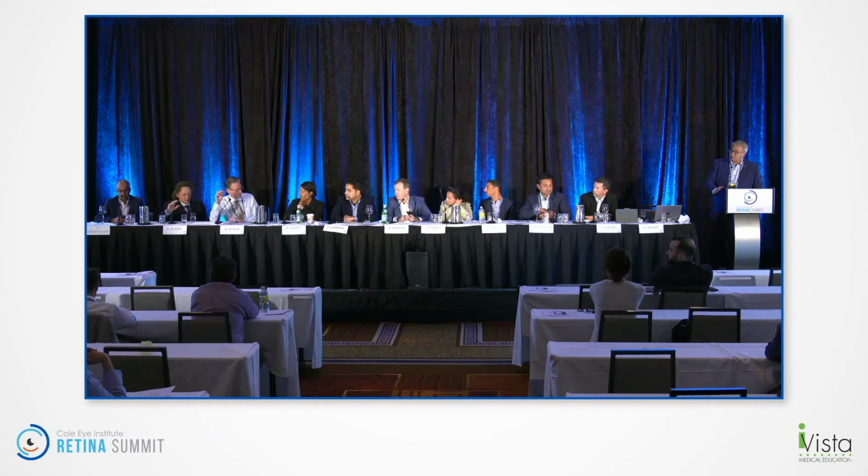Hey, Rick, your analysis, was this just using a standard Heidelberg OCT, and was it your own specific software analysis, or how'd you do it? Yes, it's my own. We changed the Heidelberg software through the A scans before the Fourier transform. That's going to be the part that's coming out. It's a slower scan that gives the greater detail. But the whole idea of then how to process it, I developed that.